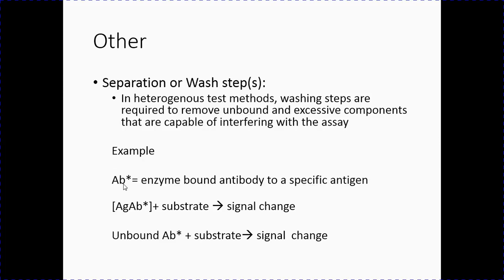One other thing before we move into looking at our immunoassays, starting with competitive first: let's talk about that wash step and why it's so important. As I said, separation steps and wash steps mean the same thing. We see them in heterogeneous test methods. By definition, a heterogeneous test method includes a minimum of one wash step, maybe multiple. The wash steps are really important to remove any unbound excess components that might interfere with the assay.